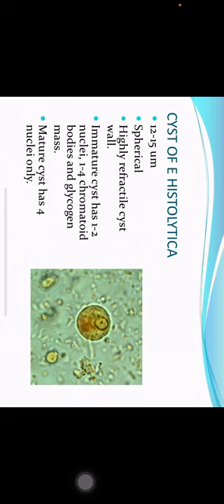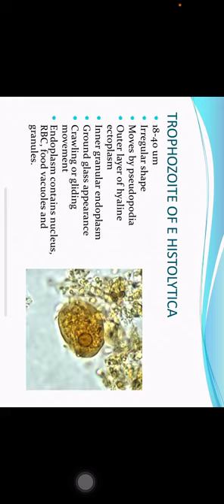Trophozoites of Entamoeba histolytica: 18 to 40 micrometers in dimension, irregular in shape. They move by pseudopodia and have an outer layer of hyaline ectoplasm and an inner layer of granular endoplasm. The appearance is ground glass. Motility is of the rolling or gliding type. Inside the endoplasm, the nucleus can be seen, as well as RBC-containing food vacuoles and granules.